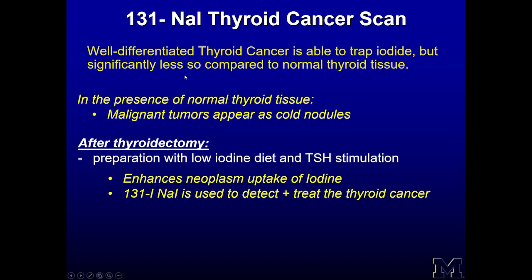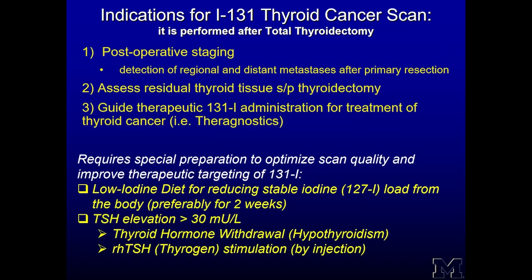iodine-131 scan is performed to detect and treat thyroid cancer. So this preparation with low iodine diet and TSH stimulation is absolutely required for optimizing iodine uptake in the neoplasm and to increase radiation absorbed dose to tumor. So these are the indications for iodine-131 thyroid cancer scan.